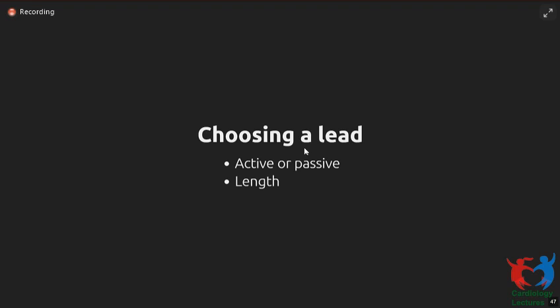Now, our practice has slowly changed from about 15 years back, putting a lot of passive leads, to switching to 50% active and 50% passive leads, to over the last 5 years or so, all our leads are now active leads. So mostly we use active leads. The advantage with the active leads is definitely a lower risk of lead dislodgement, but most importantly the ability to place a lead in multiple different places, allowing you to give a more physiologic activation. So for that reason, we mostly use active leads.